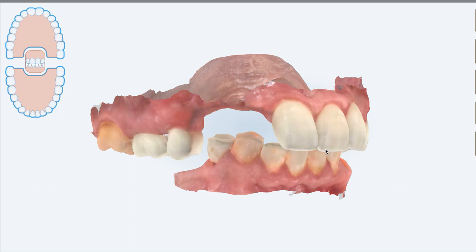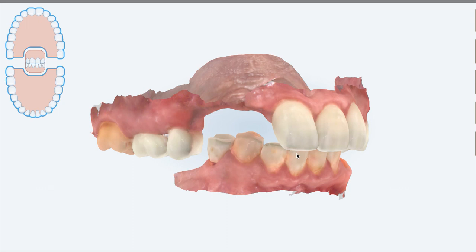You have to use somewhat soft wax for this to happen, but the wax has to be hard enough that you don't have the patient move the vertical position while you're capturing the bite because the wax was too soft. So we have this wax in the office. Please let me know and I'll show you which one it is. So essentially, I find that position and I put some wax somewhere to stabilize the occlusion. What I'm doing is I'm providing a vertical occlusal stop. I say vertical. Vertical and horizontal occlusal stop so that I've captured the mandible in the three-dimensional position at which I want them to restore the lower dentition with the wax up.